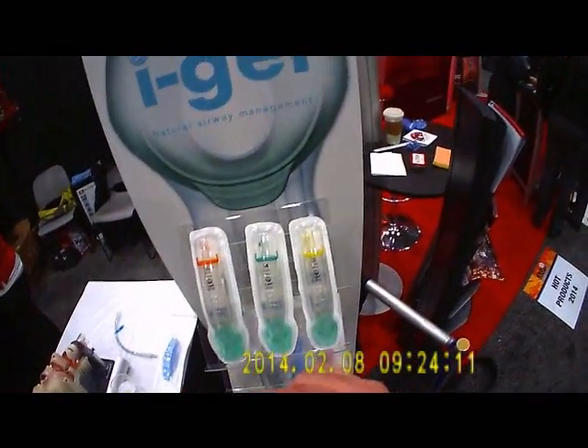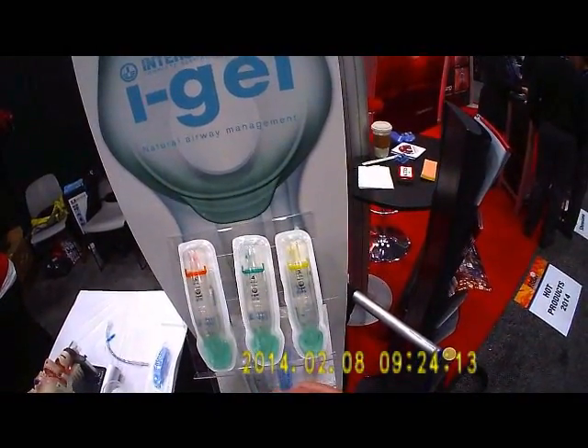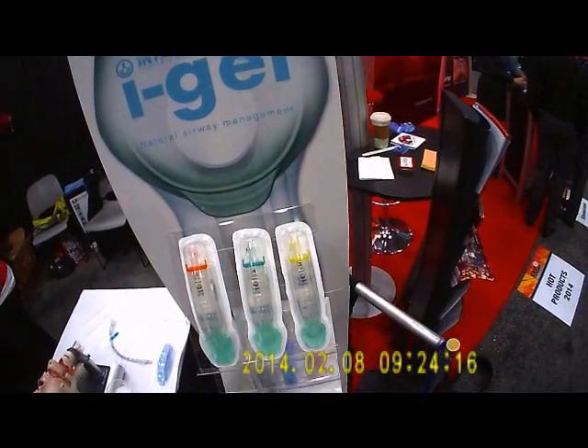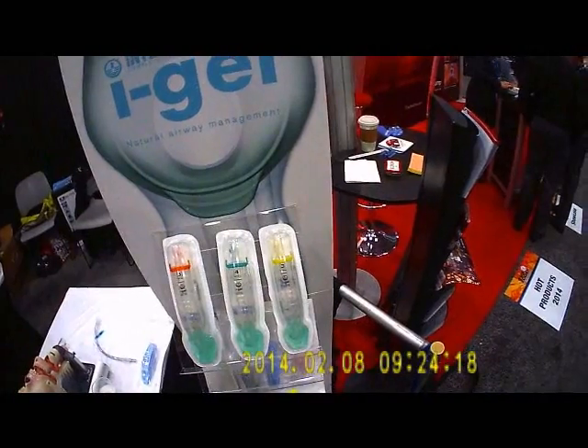The really cool thing about it is it's got a constant insufflation port. You can plug in oxygen at 15 liters a minute, and it can deliver 100% oxygen to your patient.